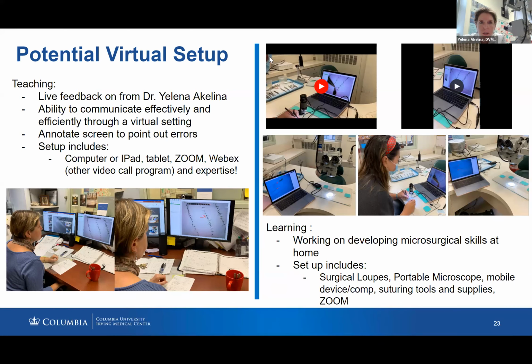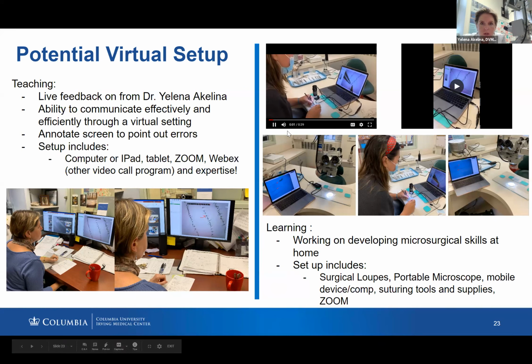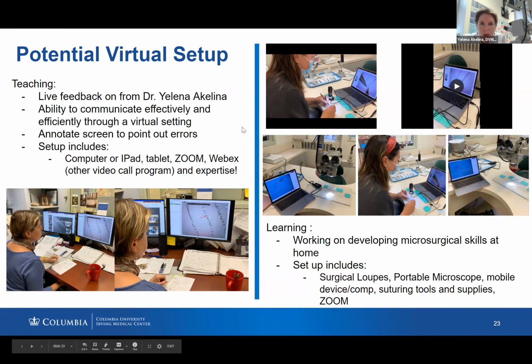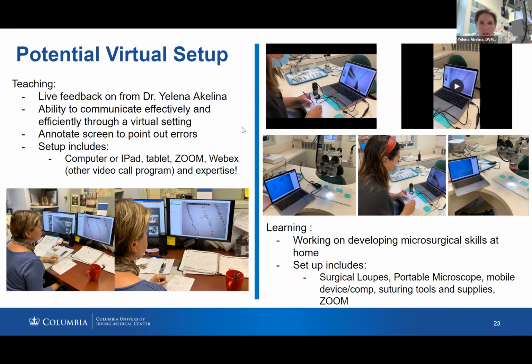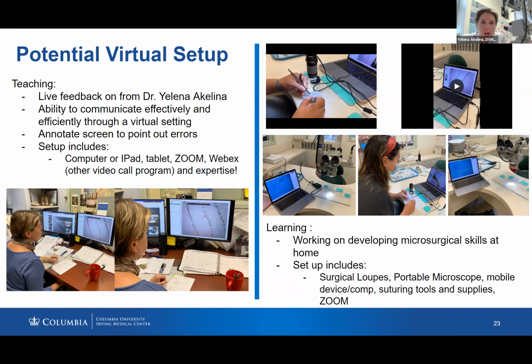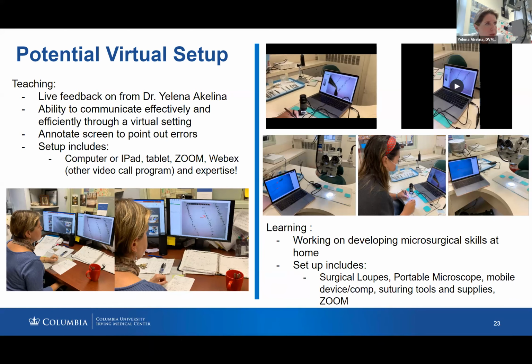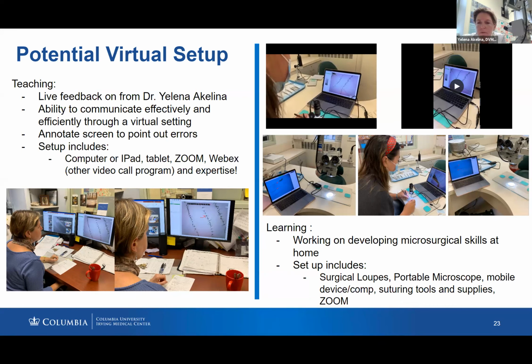So again, we are trying to do this. I'll show you how my assistant works with this camera, and you will see what's going on. She is trying to put the sutures on the glove using this small gadget that we bought for like $30-40 on Amazon. If you're interested, we can send you information, but it's pluggable, right? And you can find it online.